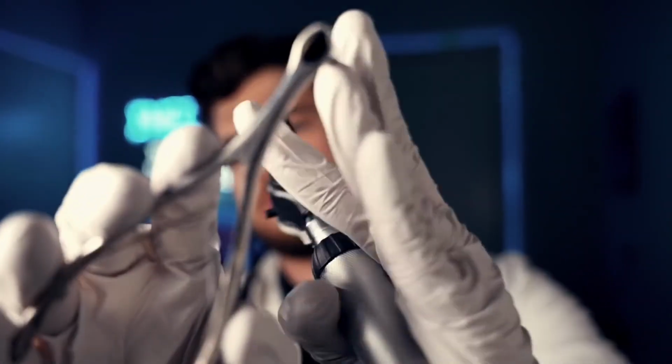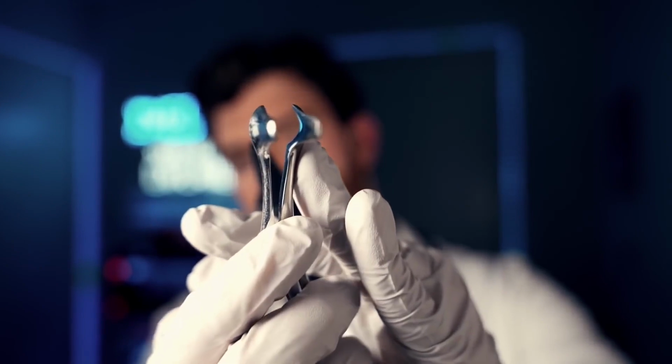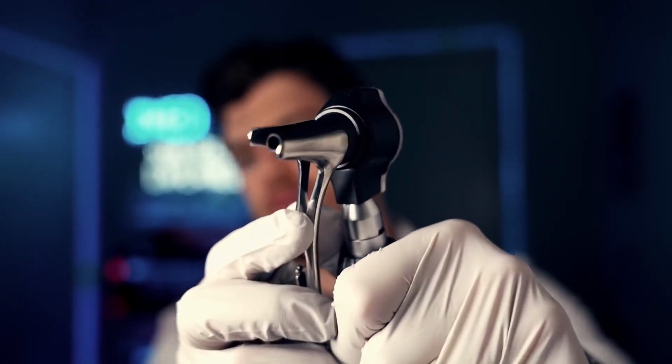It's a great question, and I'm happy to show you. It's nothing to be concerned about here. This is the speculum here, and it's very small. And it just allows a passageway for me to pass the otoscope through, just like this, so that I'm able to see more clearly inside the nose. Okay? All right. Well, a little pressure here. Good. Much better. No signs of a septal hematoma. We'll go the same here.